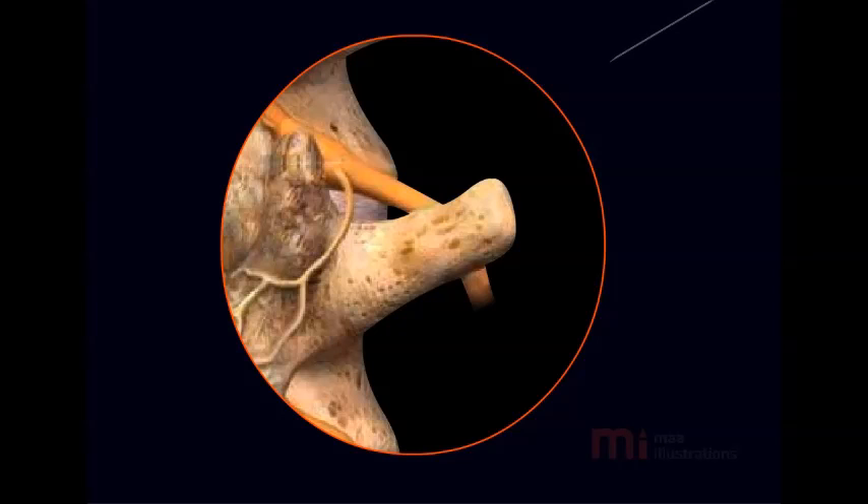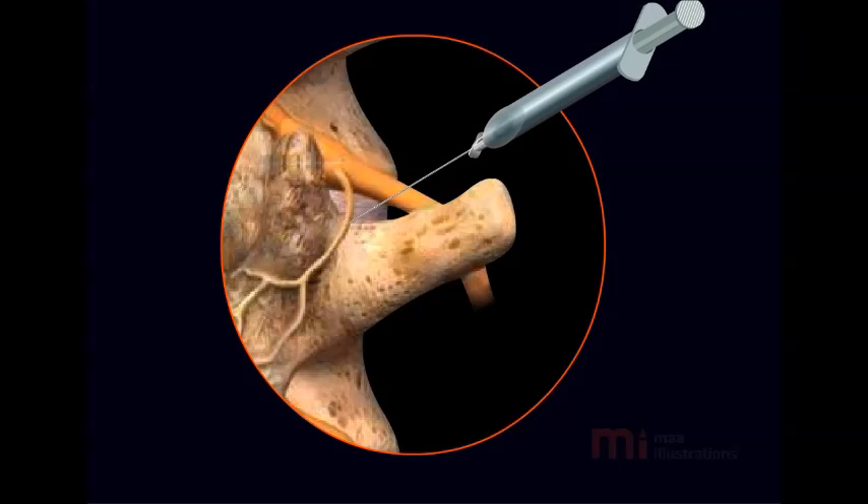Dr. Krishna is highly experienced in performing Radio Frequency Treatment. The procedure is done under local anaesthetic.